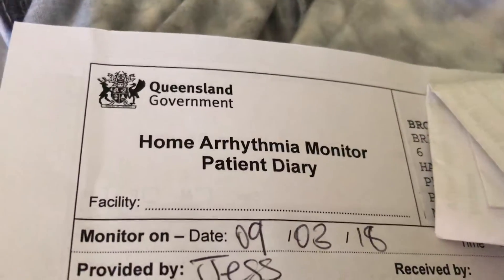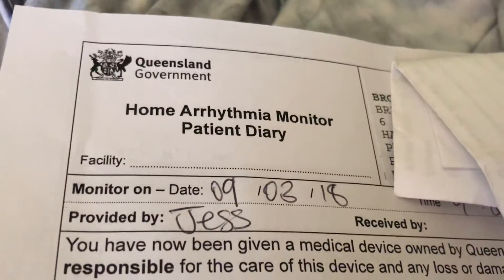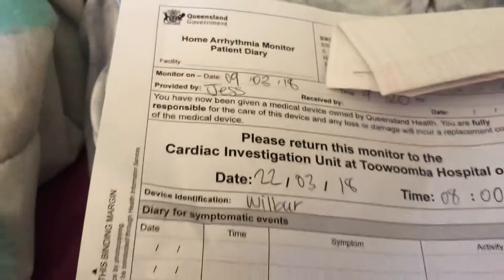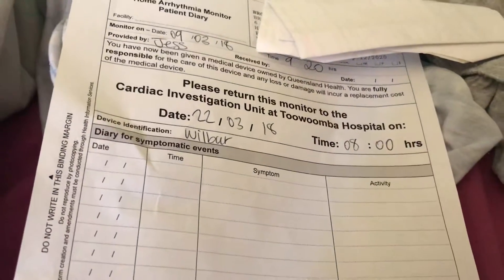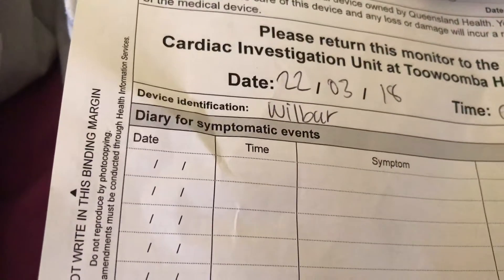Good morning YouTube and Facebook followers. I went up to Toowoomba Base Hospital this morning and they've given me a heart monitor to have for 13 days. It's due back on the 22nd. The device is called Wilbur — this one here.